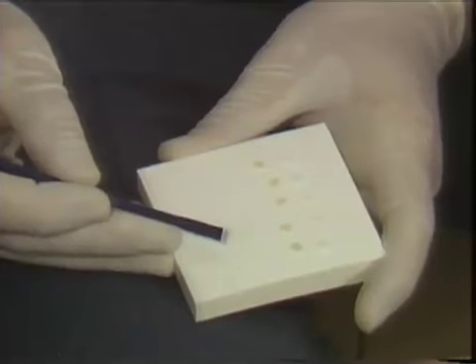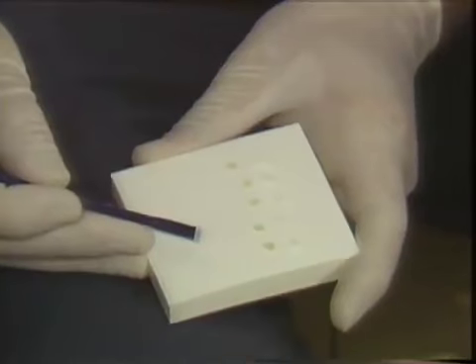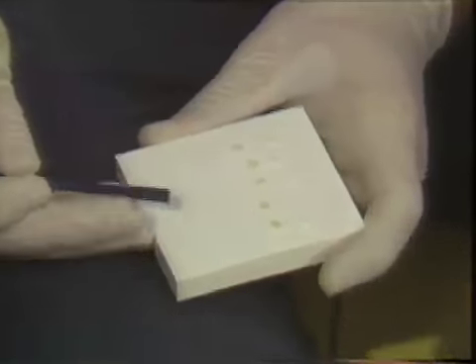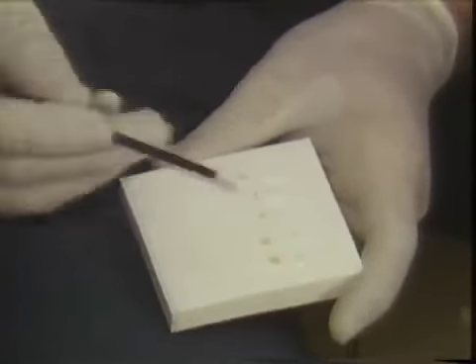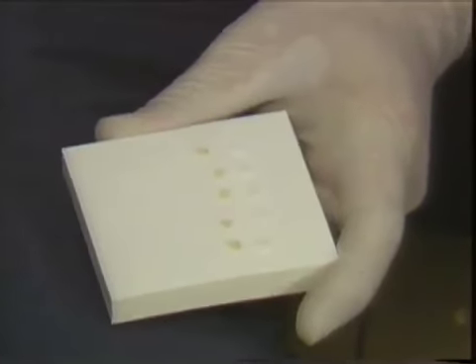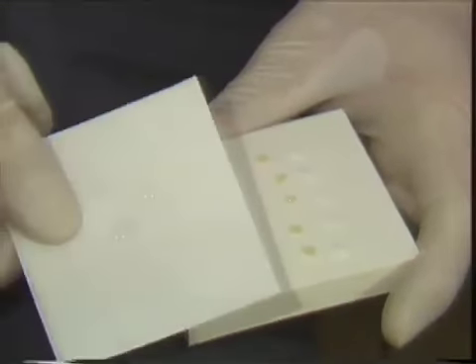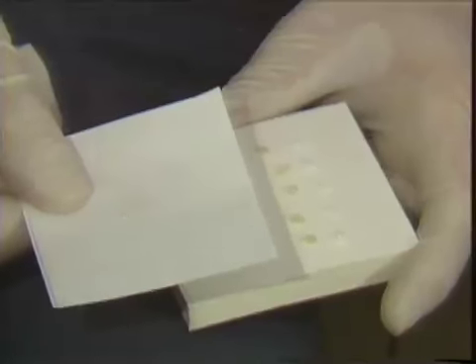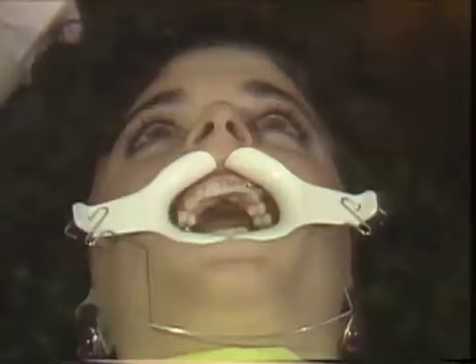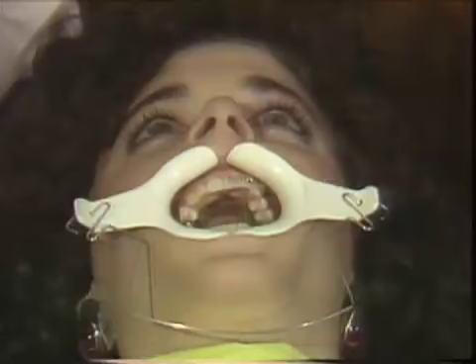The right side of the dental arch will be bonded with Phase 2, which is a mixed system. Paul, what's the difference between Reliabond, which we're using on the left side, and the Phase 2? Phase 2 is a mixed system where your first step after etching would be the mixing of an A and B sealant, a liquid sealant, and that would be painted on the enamel surface in a thin layer. And then an A and B bonding paste would be mixed and applied to the bracket. The mix system produces a little bit more bond strength than the no-mix system. And second of all, it is not as critical as to how well the bracket base conforms to the labial tooth surface with the mix system.